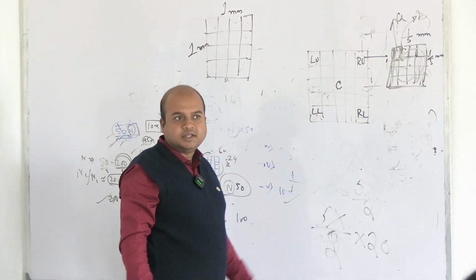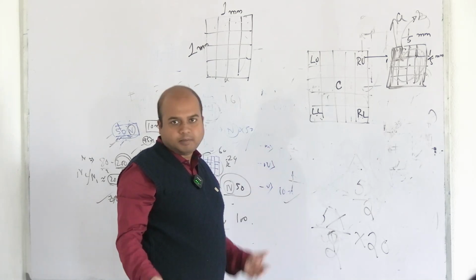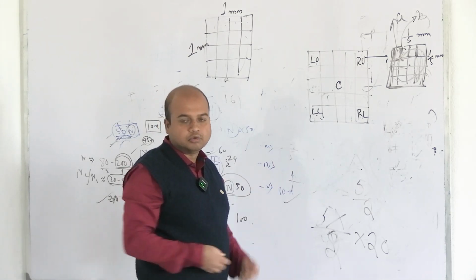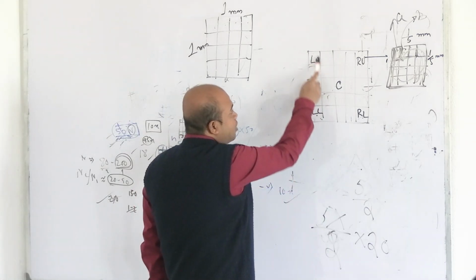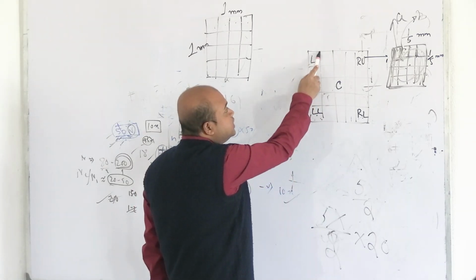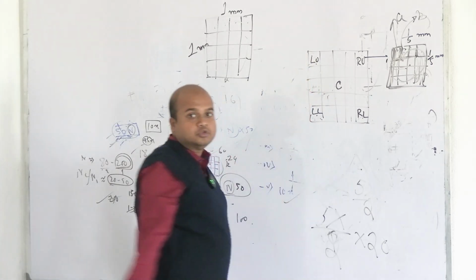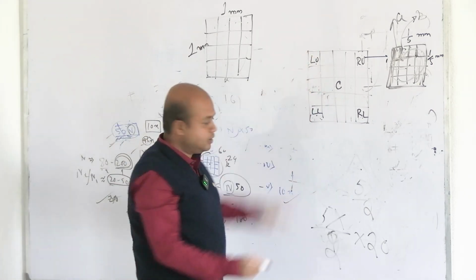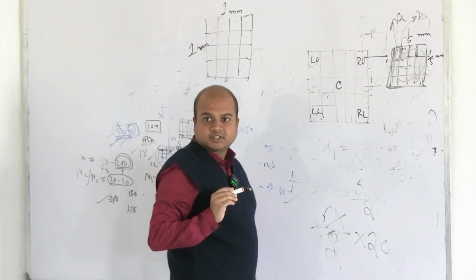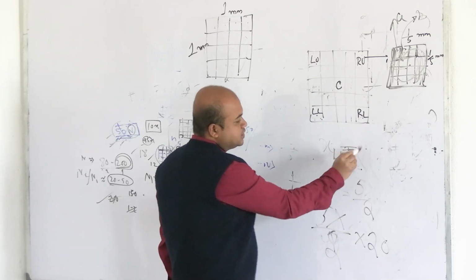In books, I think that portion is not written, but I think if you count it, it will be more accurate. There will be few cells there also. So after this is complete, by counting the 16 squares individually by the L rule, count this right margin and the upper margin. So the left upper square is complete. Right here, write x1 is equal to so many cells, or you can write it as x left upper is equal to so many cells.